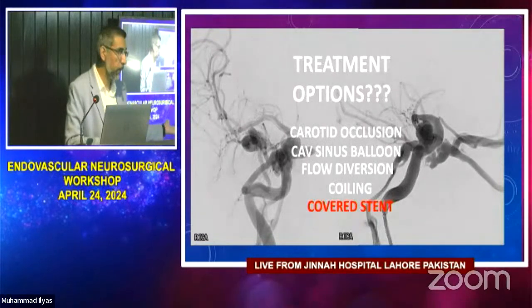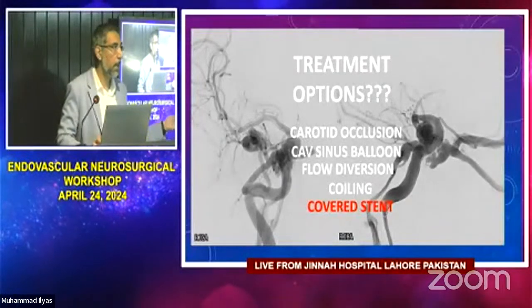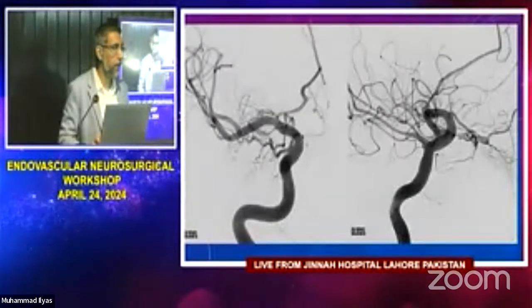And shortly thereafter, this patient shows up, and I took him to the angiography suite, and I had to apply for a humanitarian exemption device and all that stuff with the FDA that you have to do. And I put that device up, and look at that.